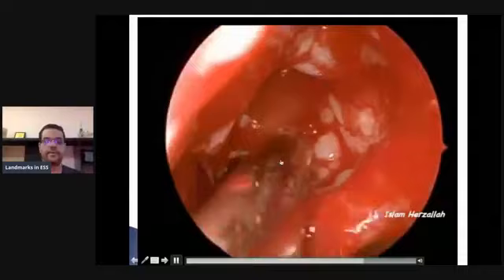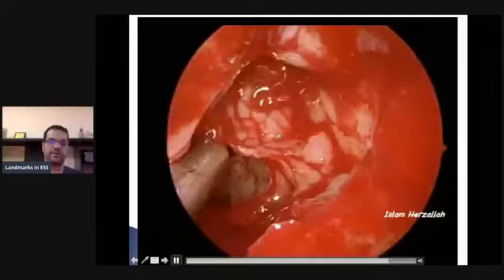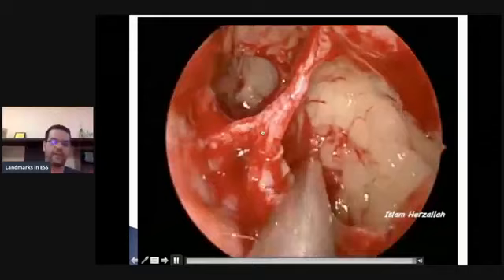So in this scenario, I'm now trimming this area as well. And now I'm removing the party wall between the posterior ethmoids and the sphenoid sinus. So I did not remove the superior turbinate upper half or upper two-thirds. I just removed the very lower portion that does not have that many olfactory fibers, and then the patient would not end up with hyposmia.